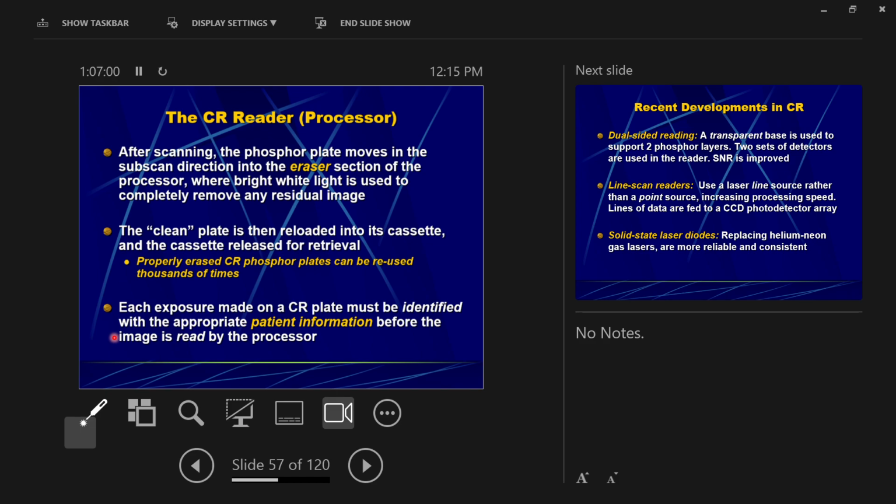With film, we used to have an ID that was flashed onto the film with the patient's information: name, date of birth, date of exam, all that stuff. It was actually attached to the film. Most of mine have been clipped off because, under HIPAA law, we're not supposed to have patient information flying around. But let's see, does this one have it? Oh yeah, this one still has it. Check that out. Right there, top corner, right? There's all the patient's information there, okay? This was flashed onto the film and is permanent on here.